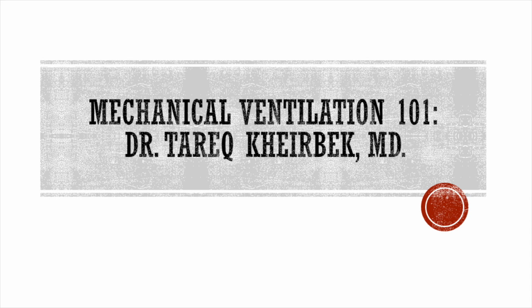I like to think of ventilator settings in two different parts: the oxygenation and the ventilation. So first thing I'm going to address is oxygenation. If a patient gets intubated, you want to start first with 100% oxygen and adequate PEEP to support the patient. Generally, we start between 5 to 8 of PEEP. Sometimes you'll have to start with a higher PEEP if the patient gets intubated for ARDS or acute hypoxic respiratory failure. And then you follow the patient's response to these settings and try to start weaning the FiO2 and the PEEP to a stable level that you can maintain the patient on.